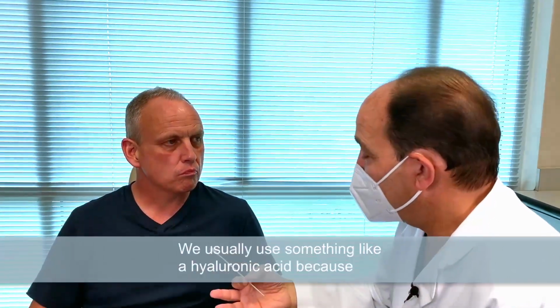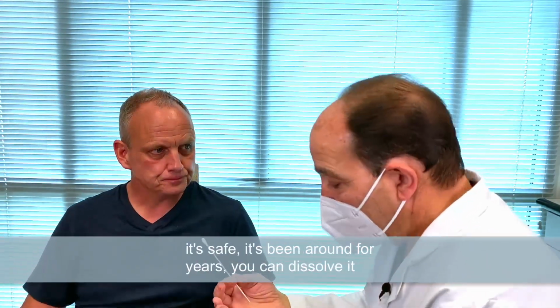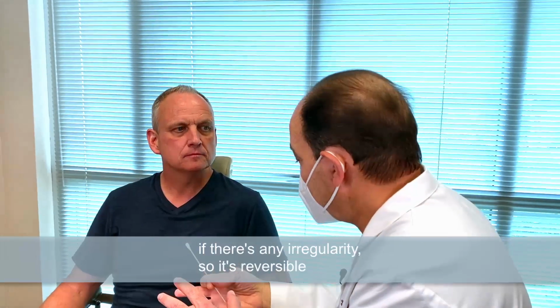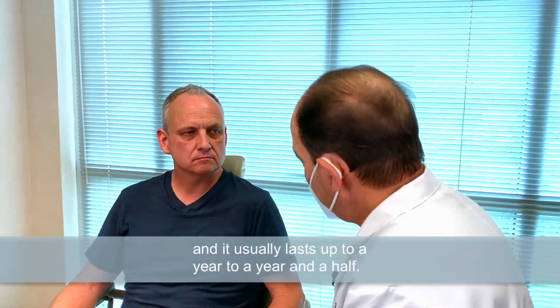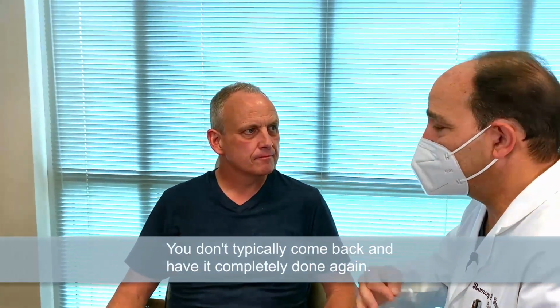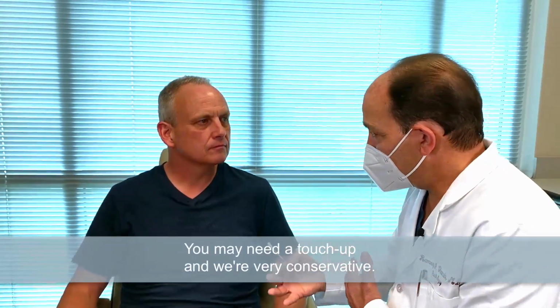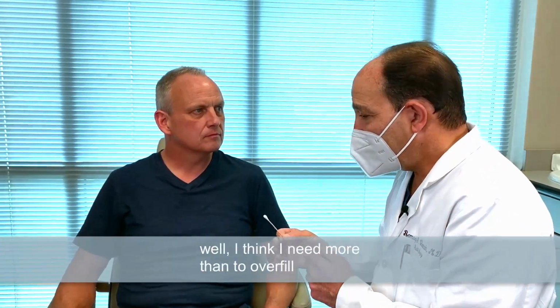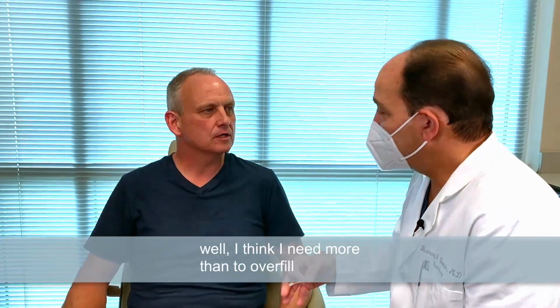We usually use something like a hyaluronic acid because it's safe, it's been around for years. You can dissolve it if there's any irregularity. So it's reversible, and it usually lasts up to a year and a half. Okay. You don't typically come back and have it completely done again. You may need a touch-up. And we're very conservative. I'd rather you come back in a couple of weeks and say, well, I think I need more, than to overfill, even though you can dissolve it.